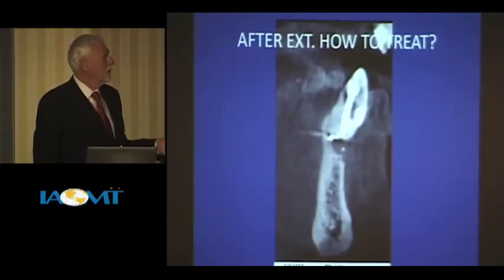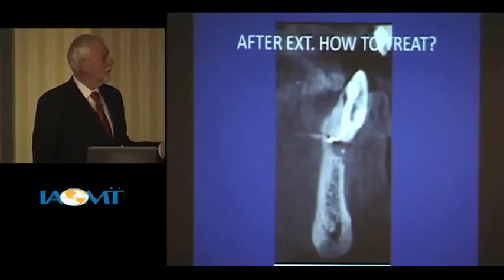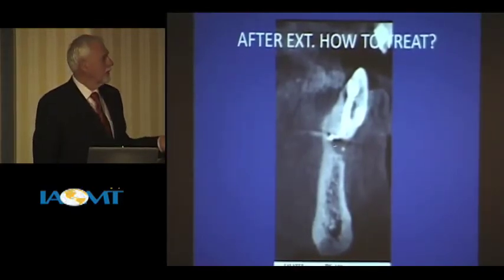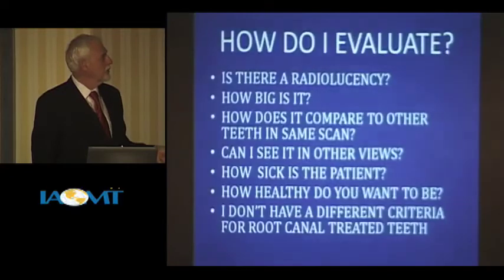What do I want to do here? Do I want to do a bridge? Do I want to do an implant? Whatever. Everybody will decide for themselves what they want to do about that. But now you've got a little piece of the puzzle. You could do an implant if you wanted. But at any rate, you know before you go in what the issues are.